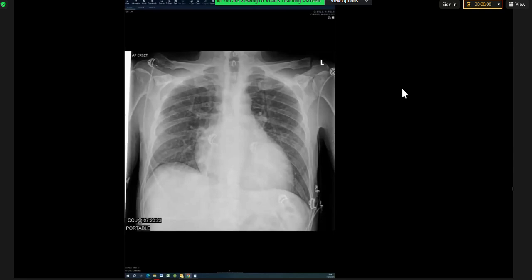Please tell me how to differentiate interstitial lung disease from pneumonia. That's probably a lecture rather than a 2-sentence answer. But the simple answer is consolidation. You want to see haziness and on a bigger scale consolidation to call something pneumonia. Interstitial lung disease needs to give you a reticulation that gives you lower lung volumes.